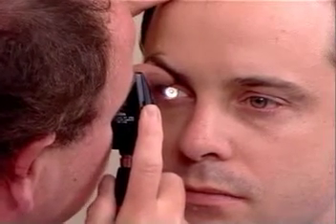And Mr. Johnson, please look at the light. And at that last second, the patient's macula has looked directly at the light, and one is looking then at the fovea of the macula.